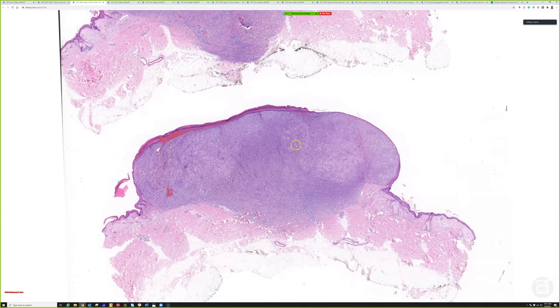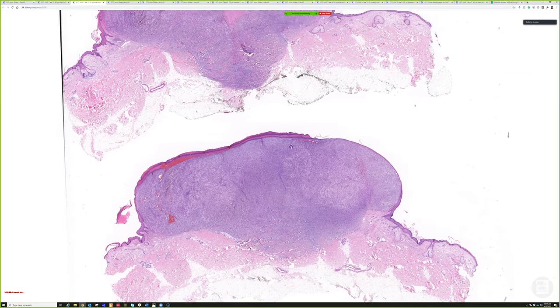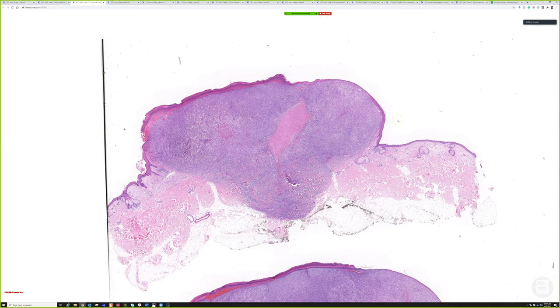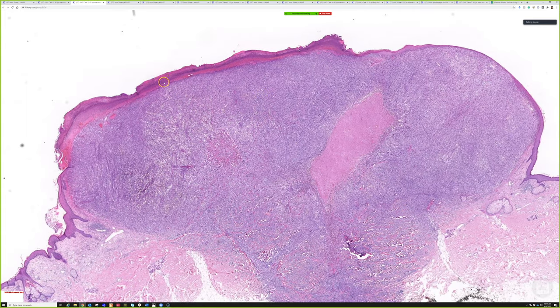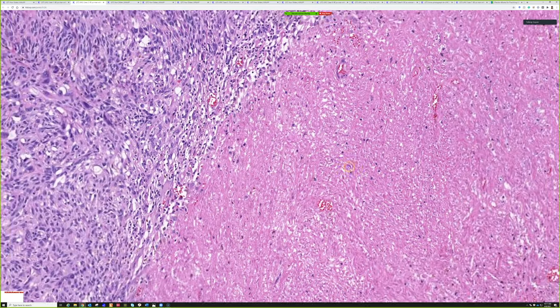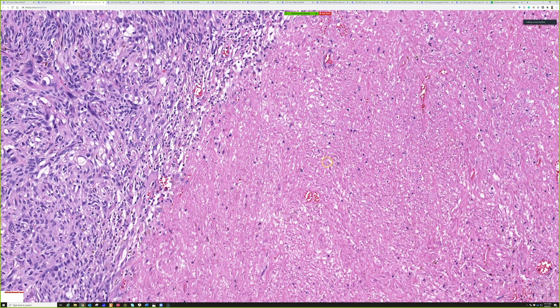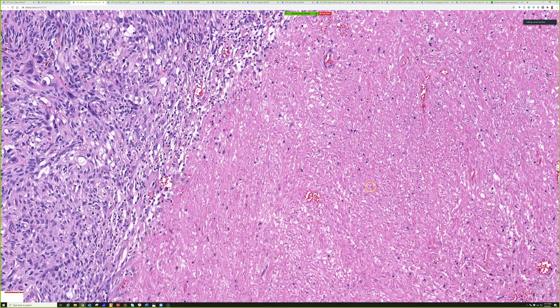At low power, this is a very cellular-looking lesion that seems to be well circumscribed for the most part. The ulceration seen grossly is appreciable at low power as well. There is also a central area of very eosinophilic material which on higher power could be some cellular debris or maybe necrosis — there are ghost outlines of dead cells here.